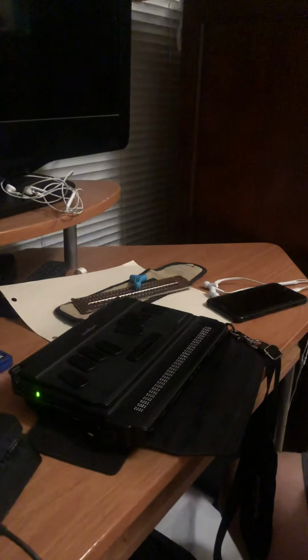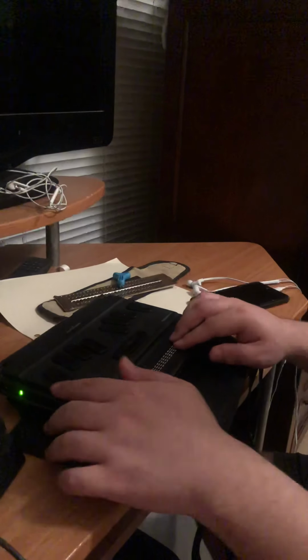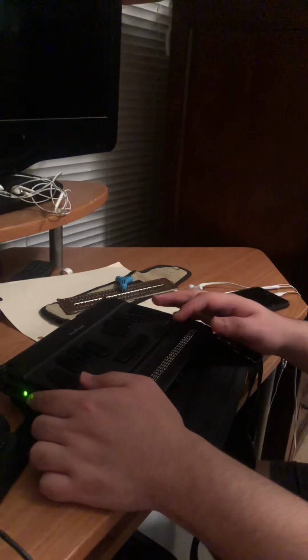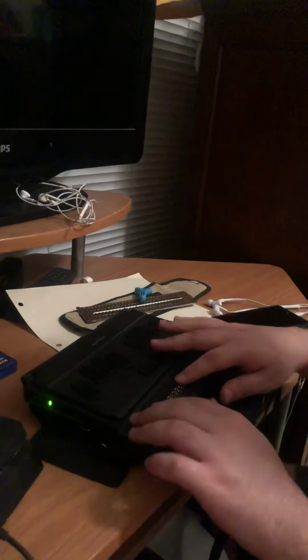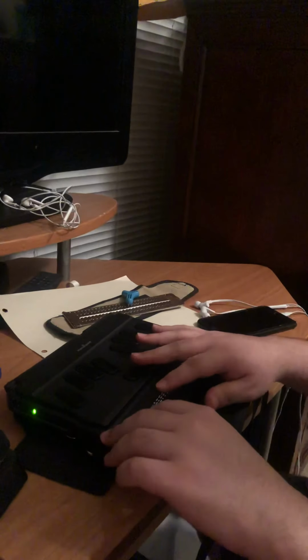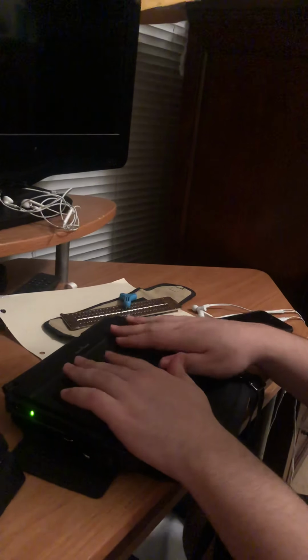But through time, technology advanced, and a lot of people came up with different concepts, and this is one of them. So I use what is called a Braillenote Touch, or just simply a Braillenote. It is a product of Humanware, and I'm going to show you guys how it works. Let me turn on my speech.